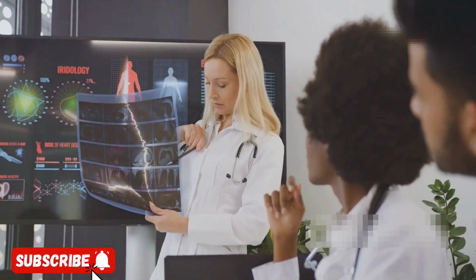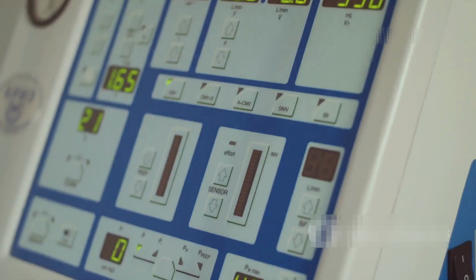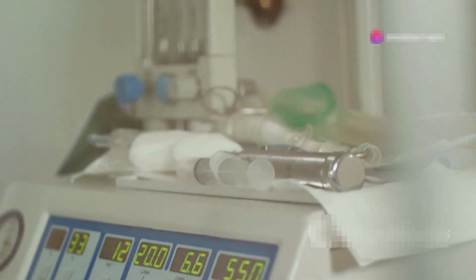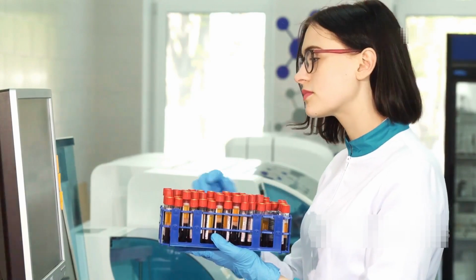First things first, what exactly is a blood gas analyzer? Simply put, it's a device that measures the amounts of oxygen, carbon dioxide, and acidity, or pH, in the blood. These measurements are vital for assessing a patient's respiratory and metabolic status.